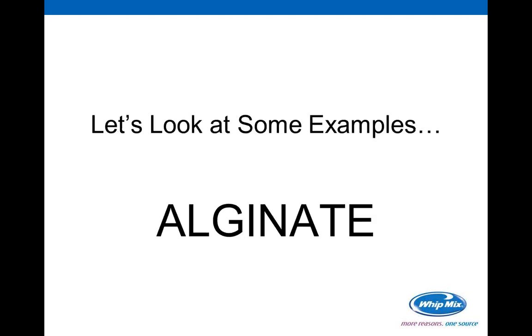All right, now, what we're going to take a look at today is some samples of things and talk about them so that you can see them on the screen here. And like Sarah had said previously, this will be up and available later on if you need to go back and review this course. So let's start with alginate. That's a common impression material that's being used right now, mostly for opposings, but our removable folks get a lot of alginate impressions also. Alginate has its own set of problems.